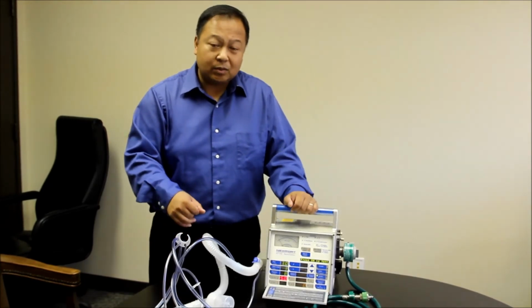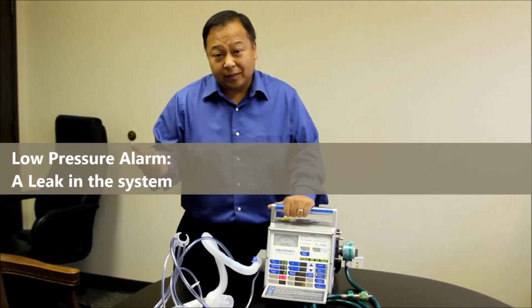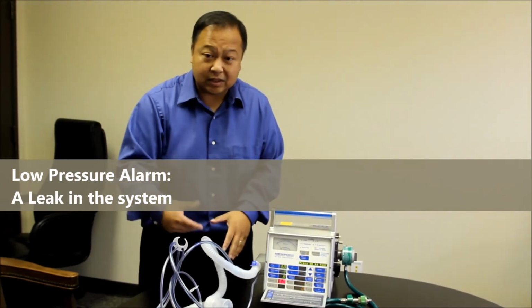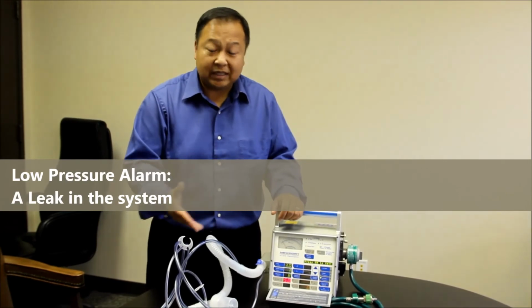So that's the most common causes of high pressure alarm. The other alarm that you're going to be facing most of the time is the low pressure alarm. Low pressure alarm is exactly what that is: there's not enough pressure in the system, and that's causing it to alarm. Most of the time, it's because of something being disconnected.